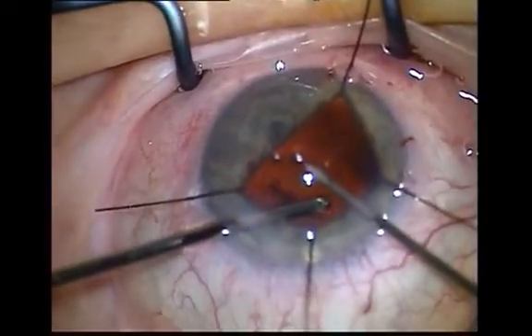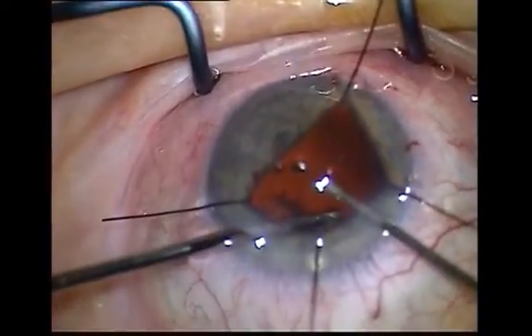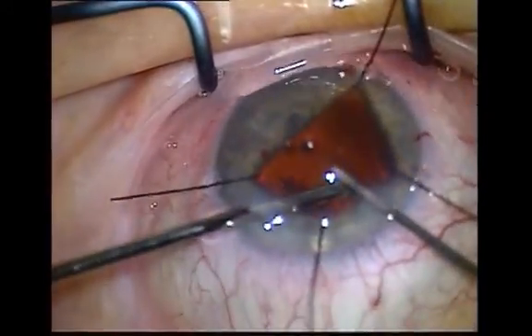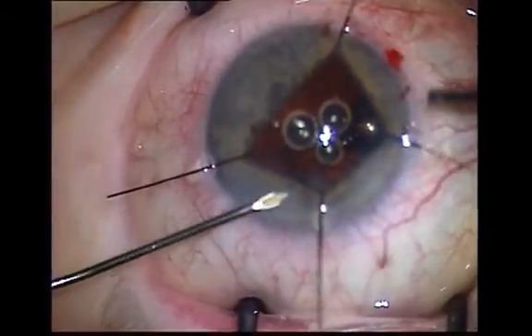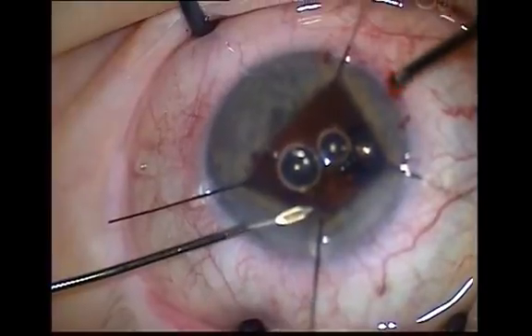If fragments of lens or cortex are lost into the anterior vitreous, do not chase them. They will often come forward induced by flow and can be dealt with once in the anterior vitreous or anterior chamber.